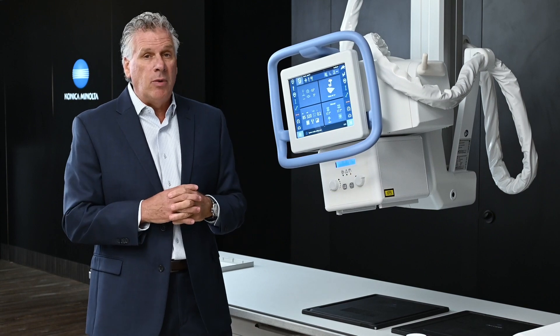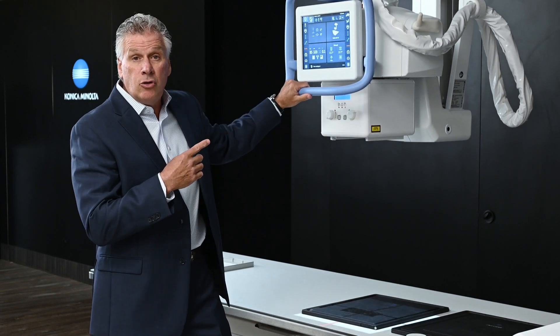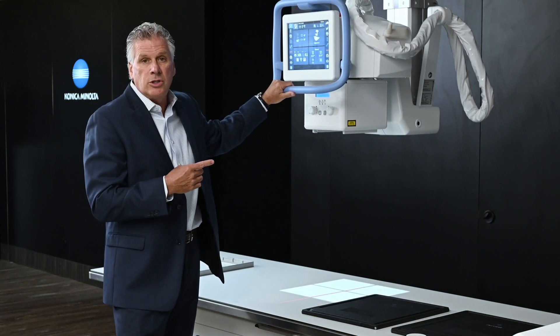Another phenomenal feature built into this is the ability to do auto walk or creep. The tube crane moves to a set position with the technologist managing where it's going to go.